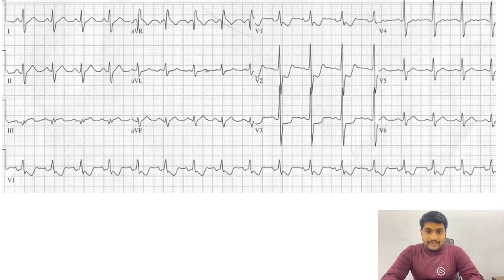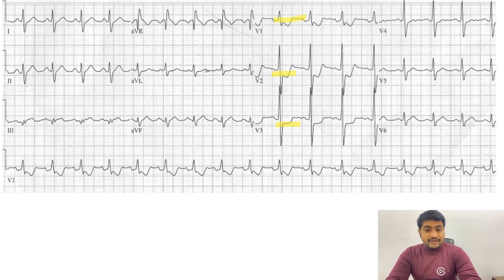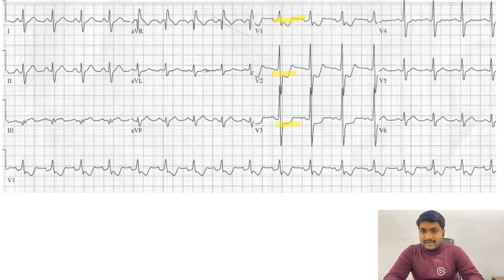So if we look at this example again, we have ST segment depression in V1, V2, V3, with upright T wave and prominent R wave. Normally when we go from V1 to V4, the R wave is very negligible compared to the S wave. But in the case of posterior wall MI, we see a prominent R wave sometimes even bigger than the S wave, then shelf-like ST segment depression and upright T wave. This is our posterior wall MI.